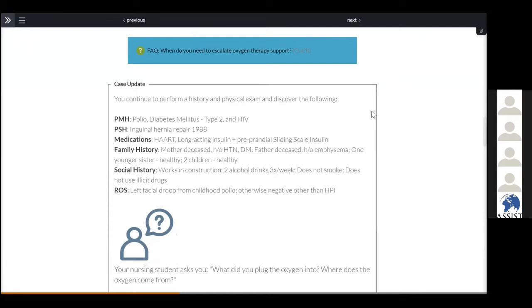So I'd like only to share with you my own experience with the Venturi mask. It's something that I didn't find in my hospital, but I was amazed to see it. I was saying about the simple facial mask, and later as we go on, the facial mask with the reservoir. The flow can go up to 15 liters per minute. If a facial mask has a reservoir, you are allowed to have that flow.